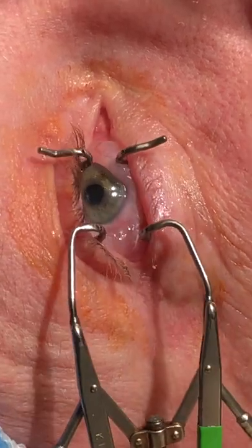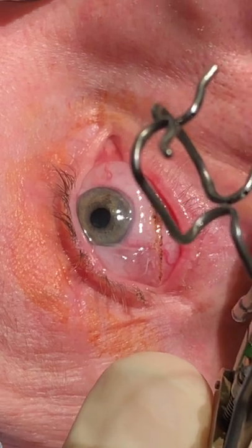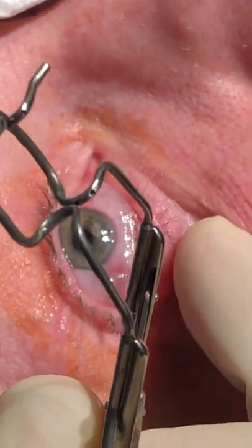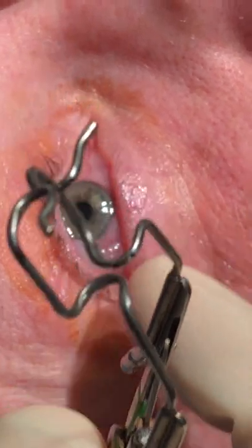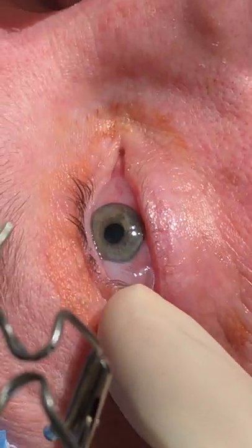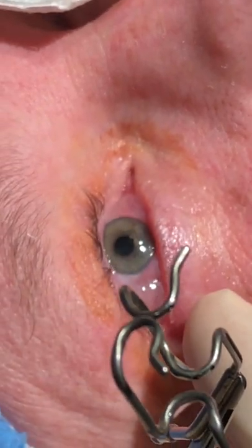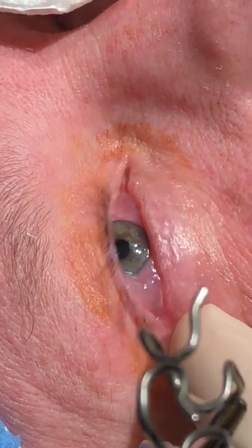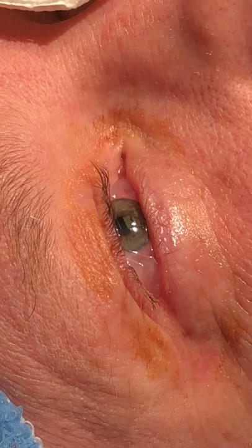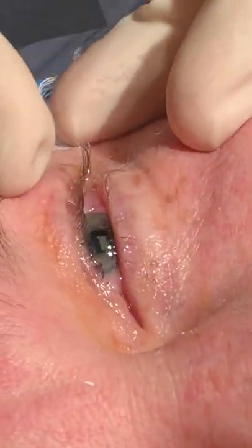One of the things I do is try to check and see — remember how it was all blown up? Now you can see that it's been tightened. When he blinks — blink for me, close your eye — the lid is going to oppose the lid. This swelling is from where I gave him the numbing injection. Blink again.